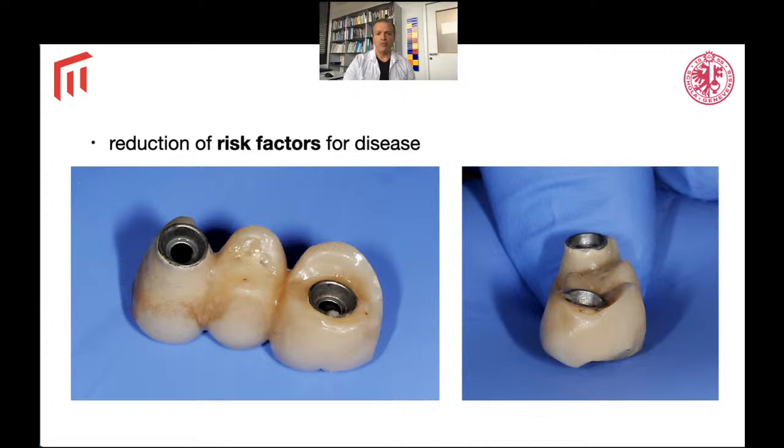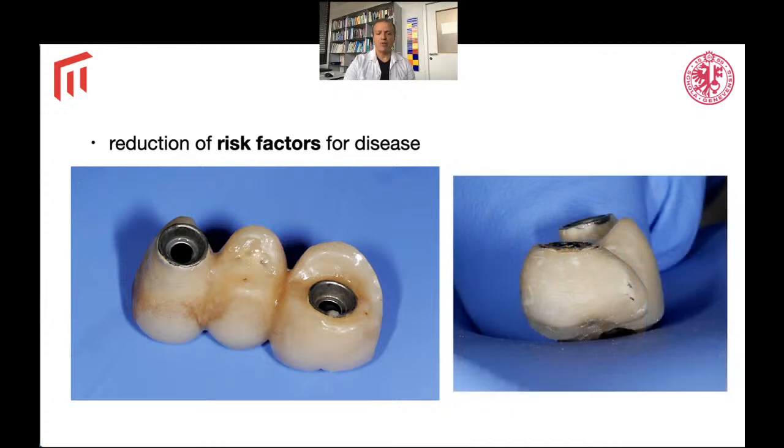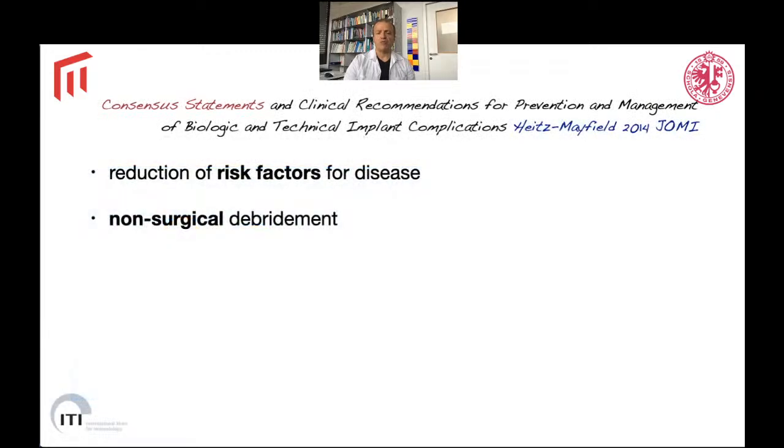This has to be removed, ground up, in order to give the possibility to the patient, to the motivated patient, to brush efficiently the area. So that is an important aspect that many times we tend to forget to perform, but it's a very crucial aspect for the success of treatment.